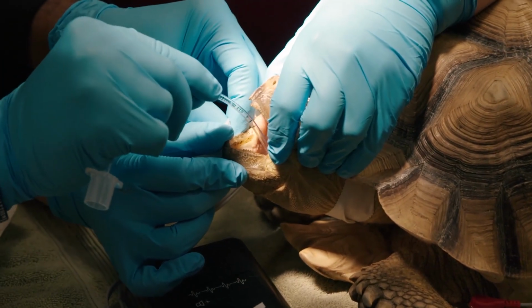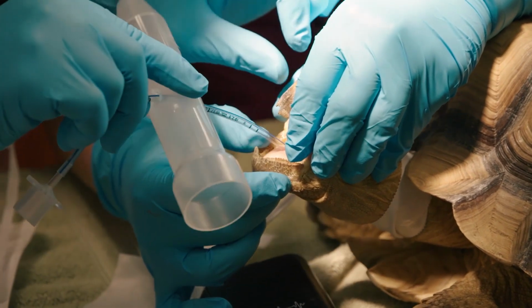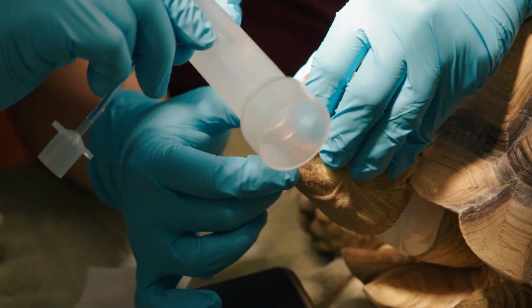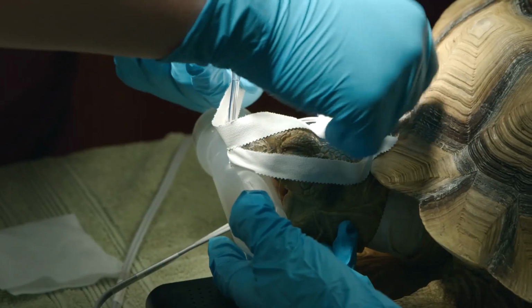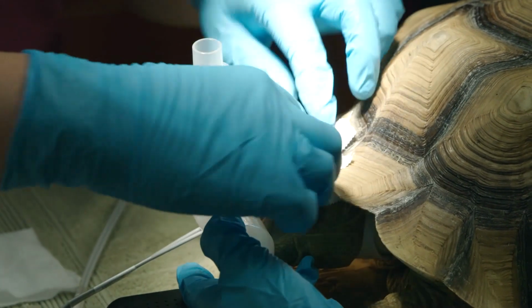So the thing about these guys is that they have a really short trachea. So the tracheal bifurcation is very high as opposed to a dog or a cat. So when you're tubing these guys, you gotta be very careful not to go too far down, or you can only oxygenate one side of the lungs, and that's not good. So I created a little plastic gadget, if you will, to prevent that.